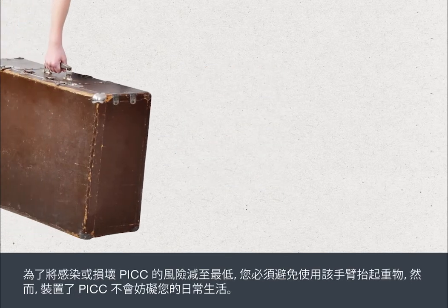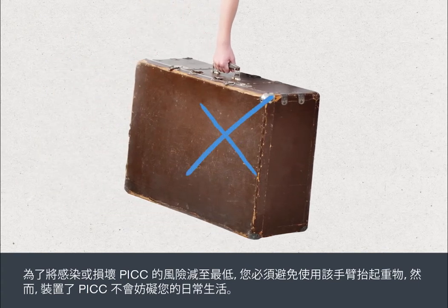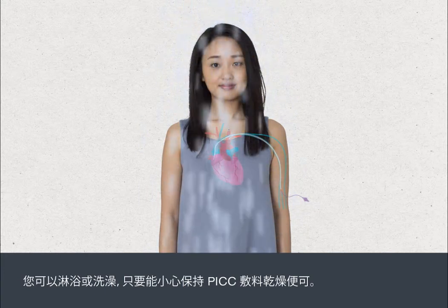To minimise the risk of infection or damage to your PIC, you must avoid heavy lifting with that arm. But having a PIC in place should not interfere with your everyday life. You can take a shower or a bath as long as you're careful to keep the PIC dressing dry.